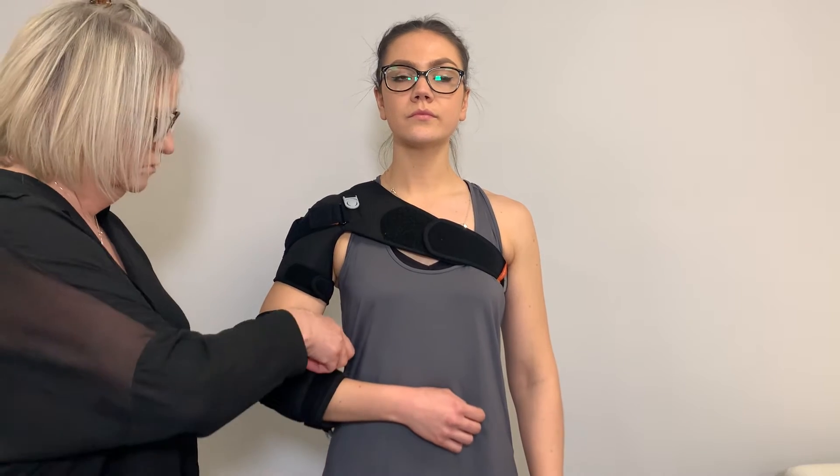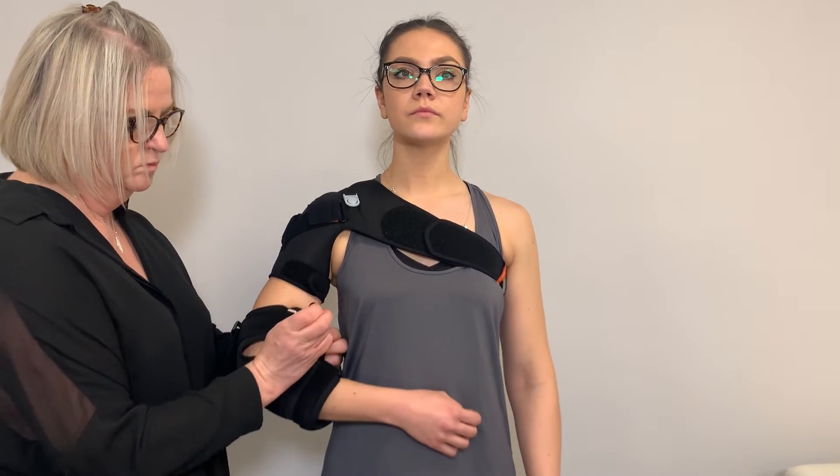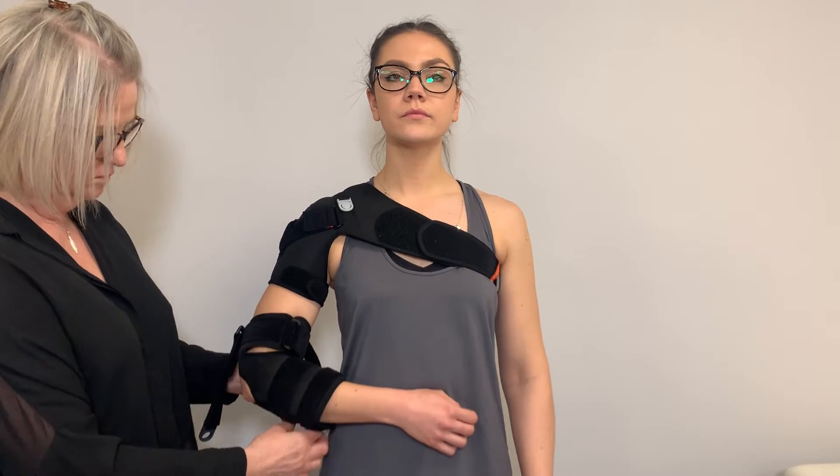Be careful not to pull the closure straps too tight, as circulation may be inhibited. This must be avoided.